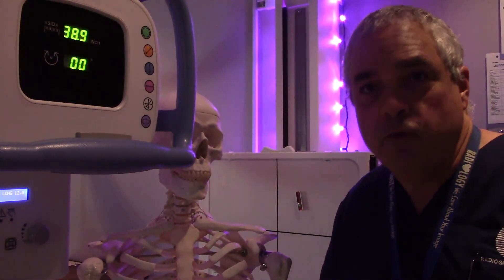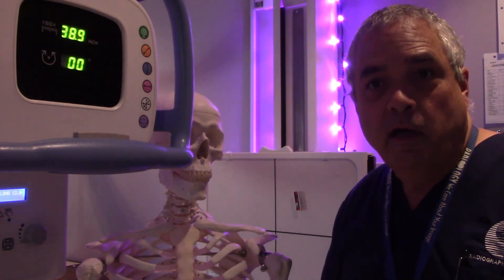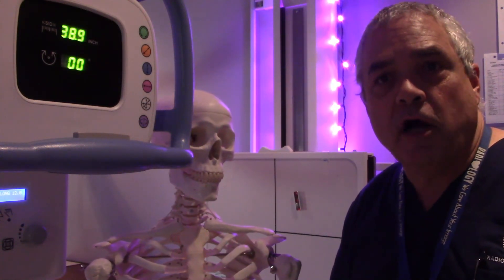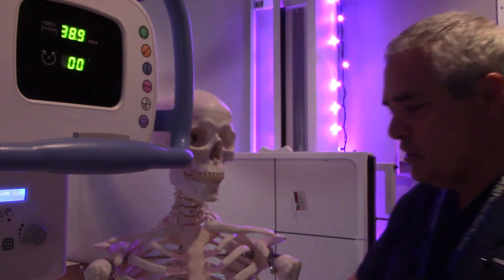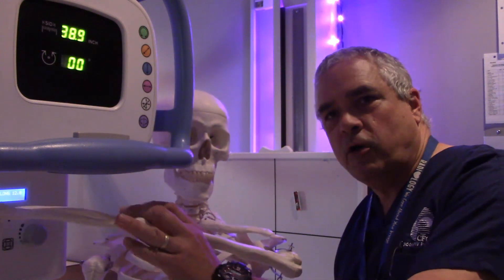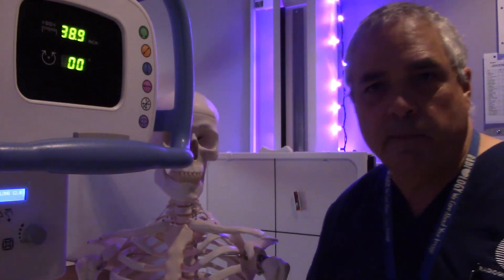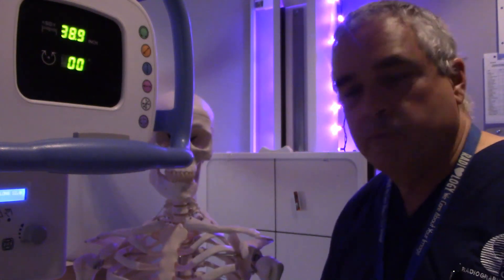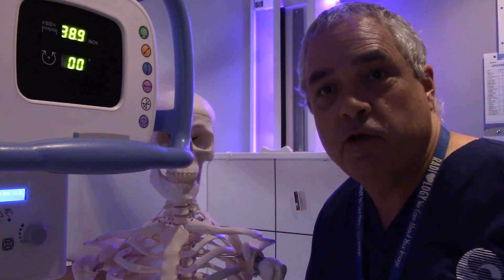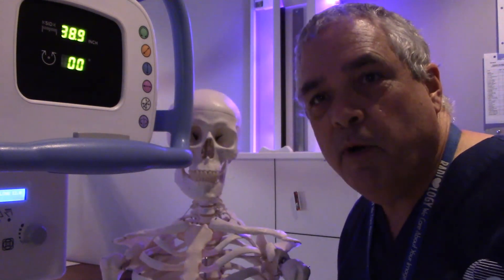That was my quick and dirty tutorial on how to do your Y-View shoulder and get it right just about every time. You can use that same methodology for the Y-View scapula — the difference there is you'll take your patient and put their arm up and across their chest to get it away from the body of the scapula, but other than that the patient positioning is the same. Thank you once again for tuning in to X-ray Education. Boney and I will see you again next time — thanks much and have a great day.